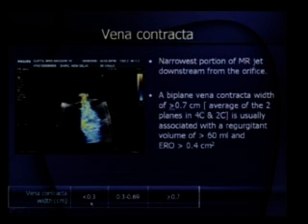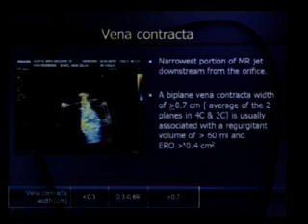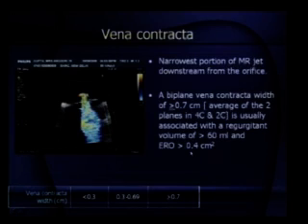Vena contracta is the narrowest portion of the MR jet just downstream from the orifice — the neck of the jet as it leaves the mitral valve. Measure vena contracta in two planes: the four-chamber view and two-chamber view, and take the average. If vena contracta is less than 0.3 cm (3 mm) it is mild; 3–7 mm is moderate; more than 0.7 cm (7 mm) is severe MR, usually associated with regurgitant volume greater than 60 ml and effective regurgitant orifice greater than 0.4 cm².